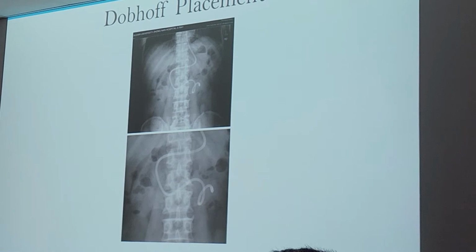But shouldn't they know that since the beginning, because that's why you're there? No, they can. So when we take the x-ray and it looks like this, that means they need to readjust the tube. They might do it at that point, or they might wait, because if they're busy, they'll say, come back later, we'll call you when we're ready.